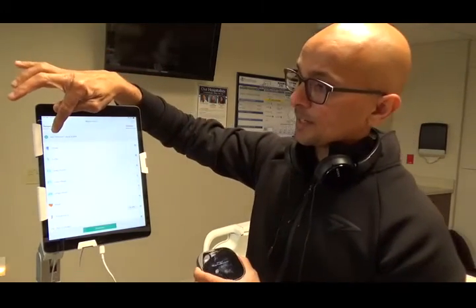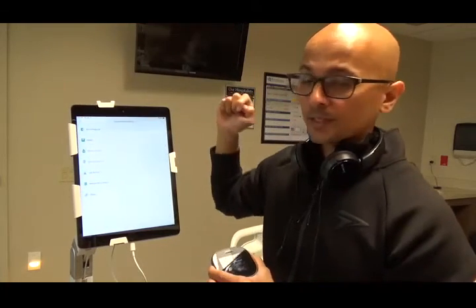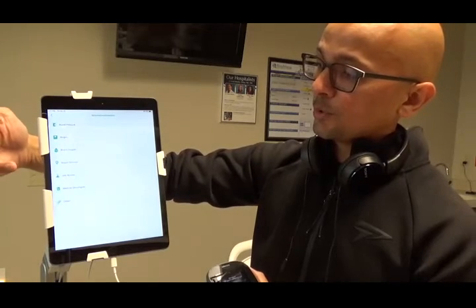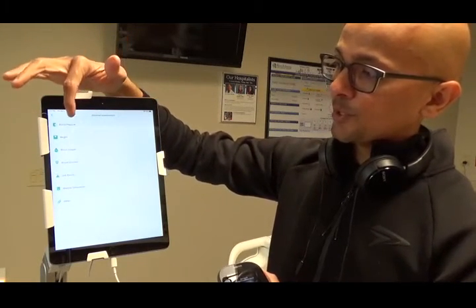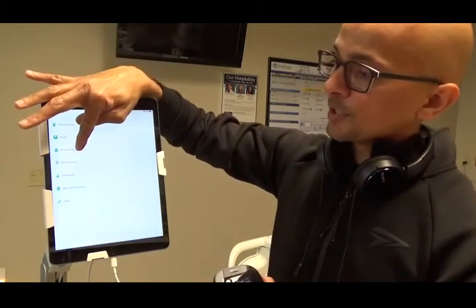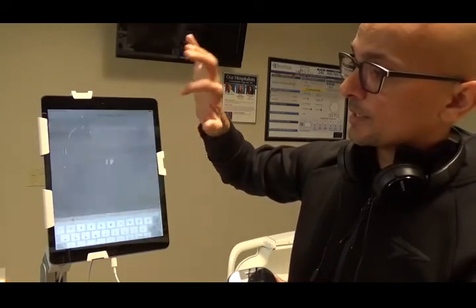On the left-hand side on the top, it says add external data. We click that. Now you have blood pressure, weight, blood oxygen, blood glucose, labs, etc. For our case, I think a lot of times you're probably going to use blood pressure and blood oxygen, maybe glucose and weight. But you could just, for example, for O2, let's say you put 87%, done.